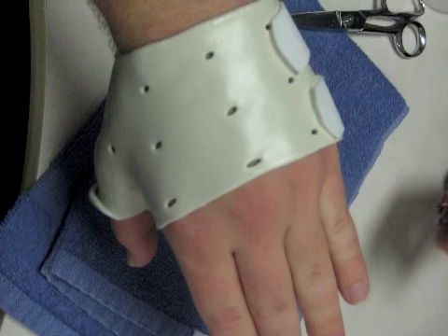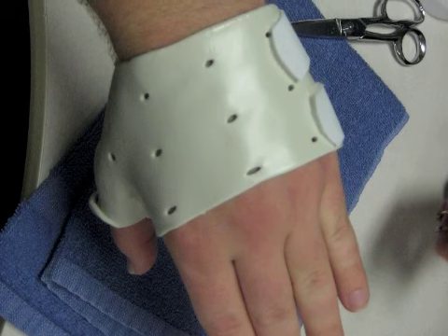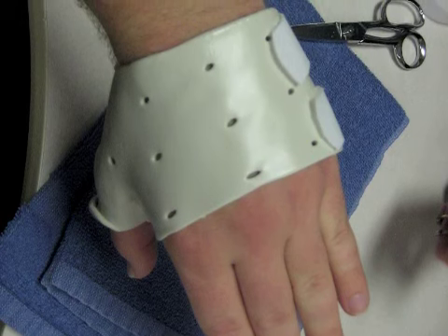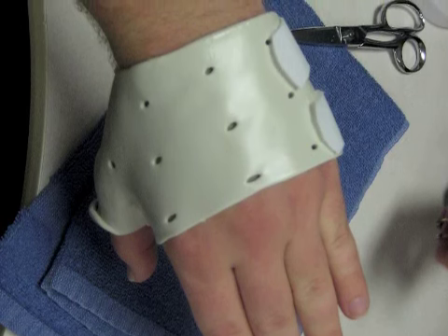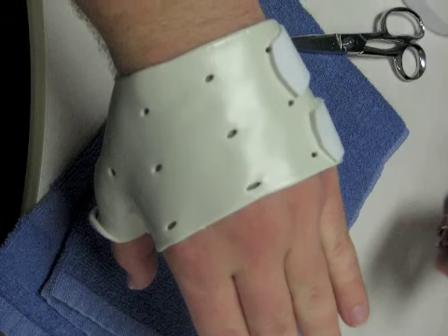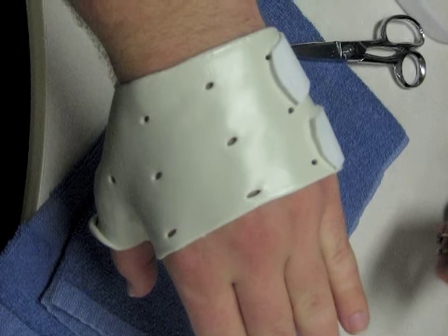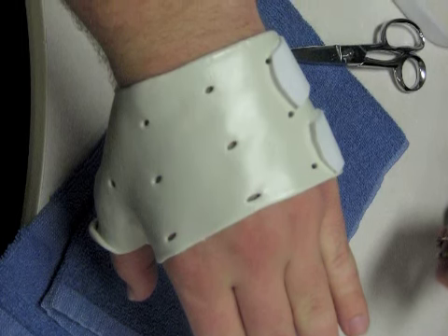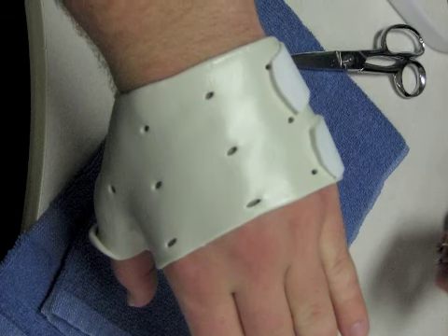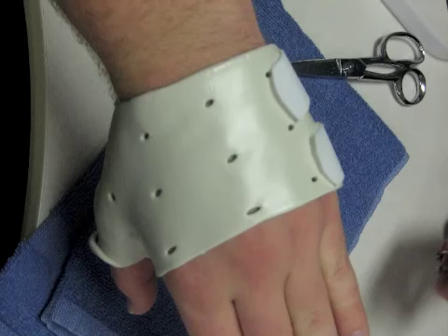The client should contact a therapist or physician immediately if there is any increase in swelling, severe pain, pressure in any areas, stiffness, or numbness and tingling. The client can care for their splint by cleaning it with warm water and soap, and cleaning the straps with warm water and letting them air dry. For hard to remove spots, soft scrub with bleach can be used — just be sure to rinse thoroughly with water. To keep the splint clean, a spray antiperspirant can be used on the hand.